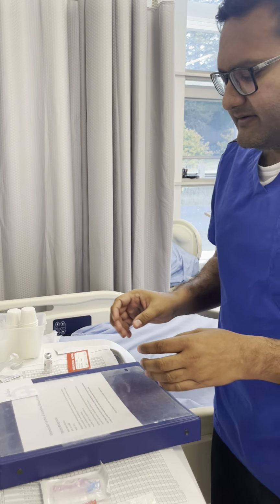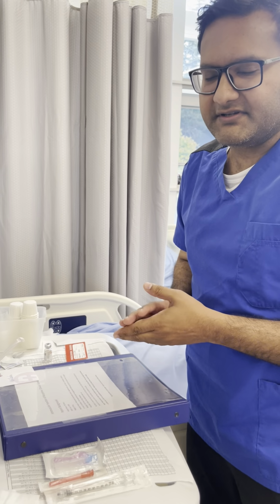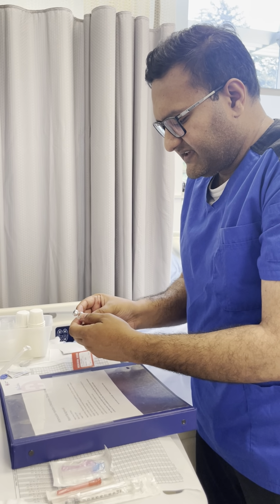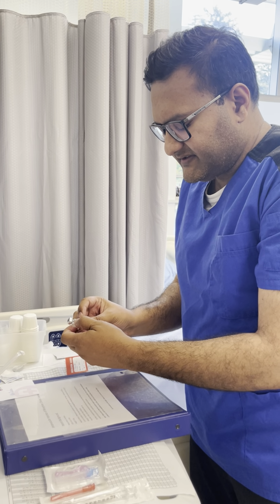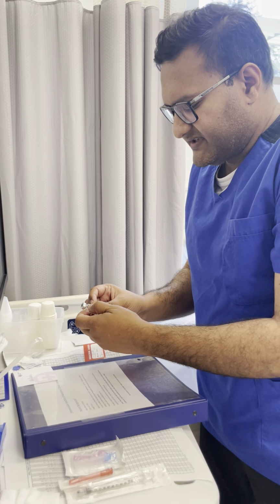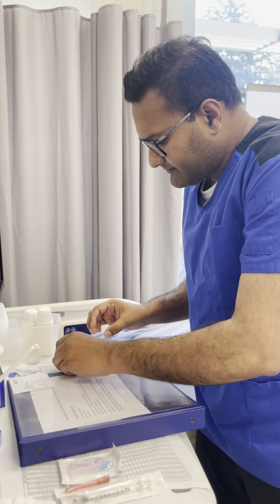Naturally, I will not try to blow on it as I will try to control the asepsis. I will now perform my second check. Again, the right patient, right medication, right route, right dose, and right time.